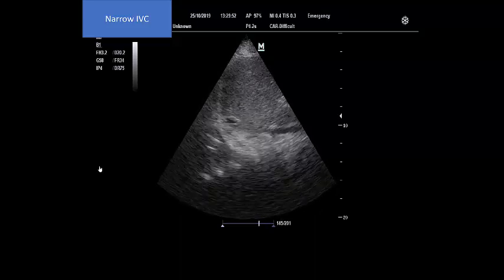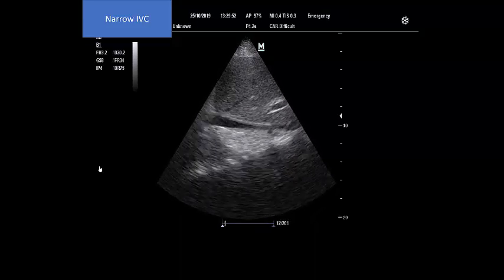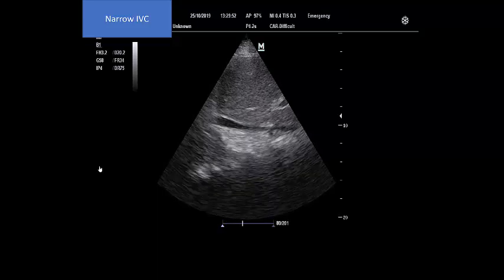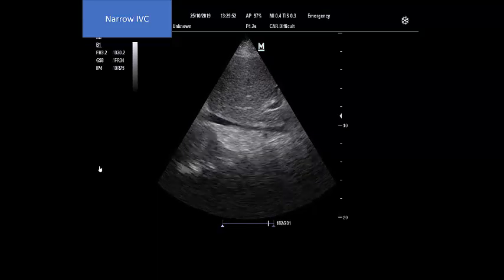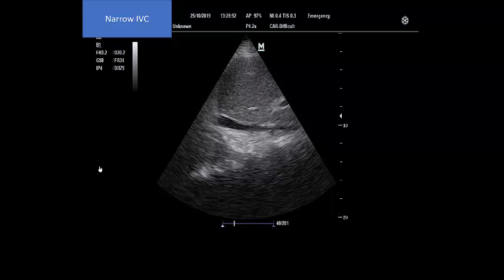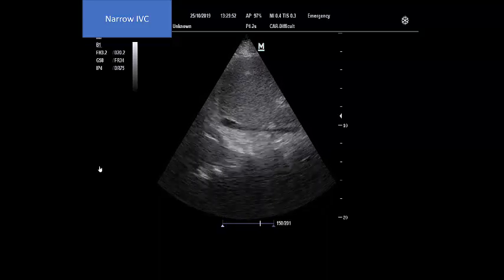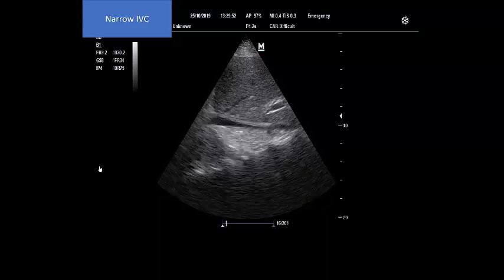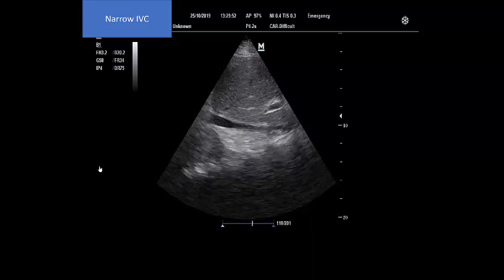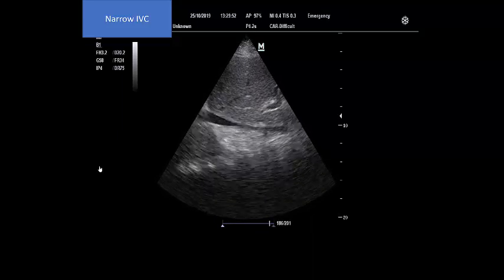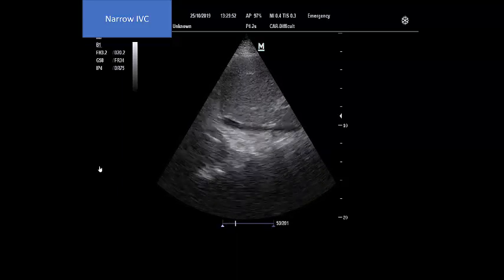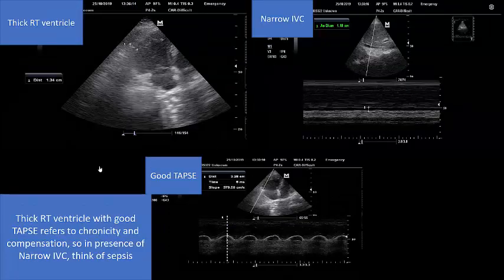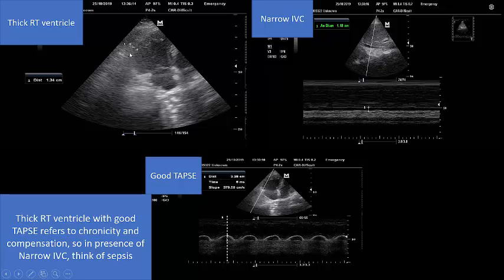In our online course you will learn a step-by-step approach. When you see the right ventricle is dilated more than the left ventricle, before going any further you must determine: is this acute cor pulmonale or chronic cor pulmonale? This distinction is very important. The first step is measuring the wall thickness of the right ventricle.